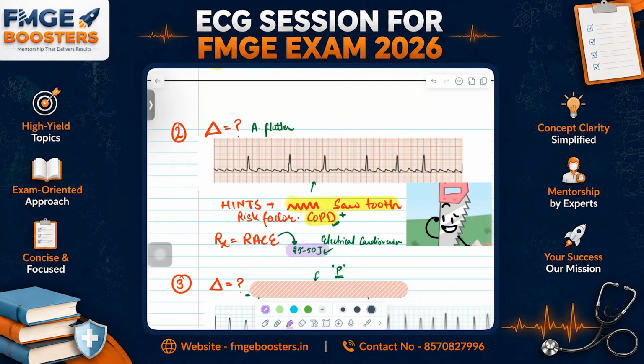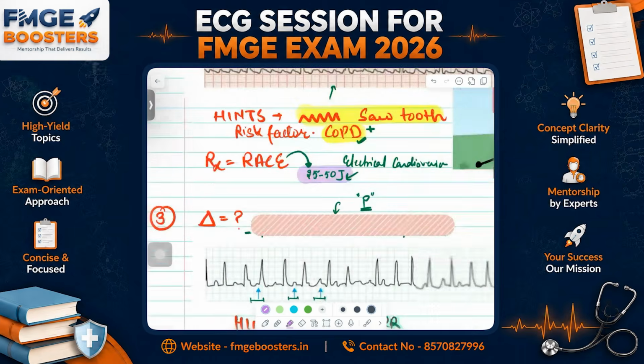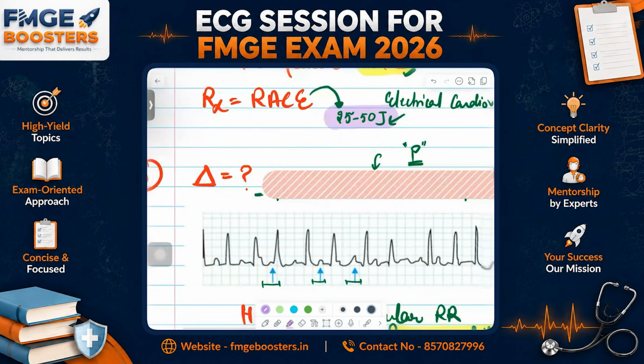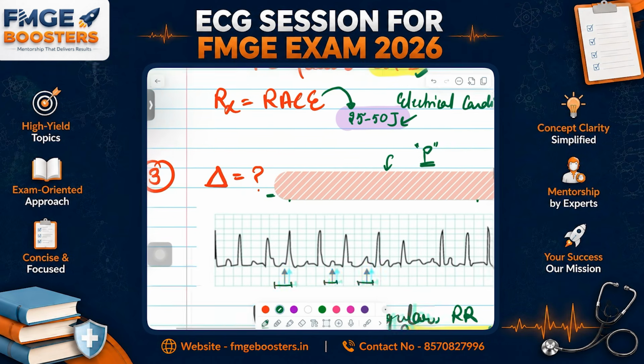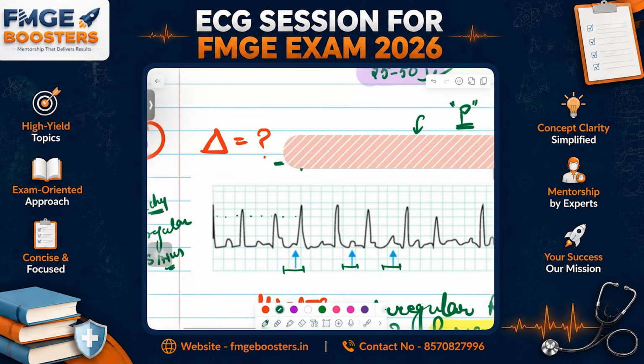These two were the most important ECGs. Now we will be moving on to slightly more complex ECGs. Now tell me about this one. Again, the ECG comes in front of you and you tell me three things: regular or irregular, sinus or non-sinus, and the heart rate. Look, we are sure this is a tachycardia, right? We know that. 1 2 3, 1 2 3, 1 2. Yes, this is irregular. And is it sinus or non-sinus? It is sinus, guys. P wave is present there. Now see, is the P wave looking the same in every complex? Is the morphology of the P wave the same or different? It is different, guys, right? Different morphology of P waves.